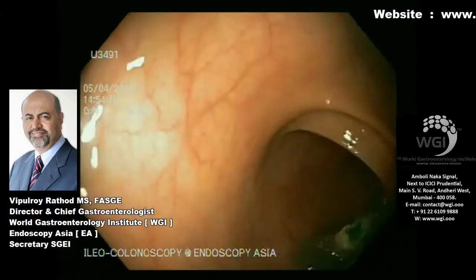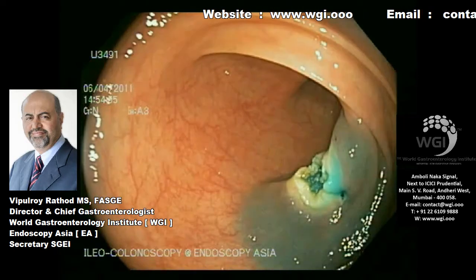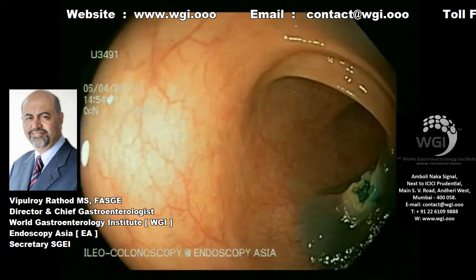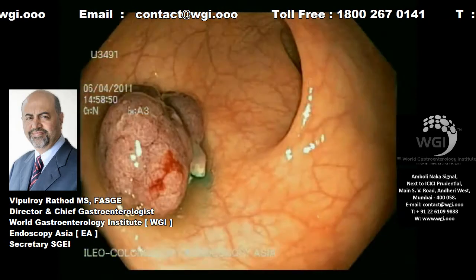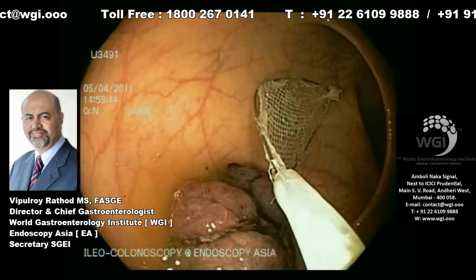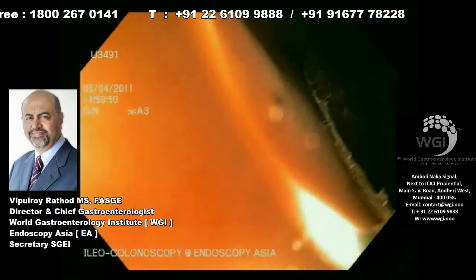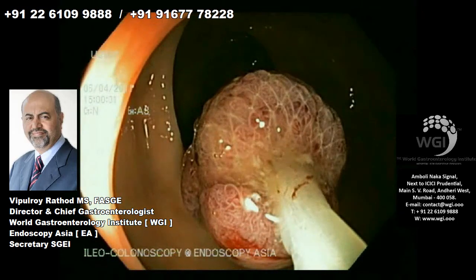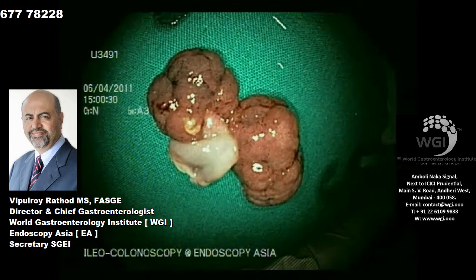It is mandatory to look at the base for hemostasis. You can see here that there is complete hemostasis — there is no evidence of bleeding. It is always mandatory to make sure that you retrieve all resected specimen. You can see a large polypoid mass. We are now retrieving it with the Roth retrieval net. You can use the Roth net or a basket to deliver the entire specimen out and then send it for histopathology. And this brings us to the end of this procedure.